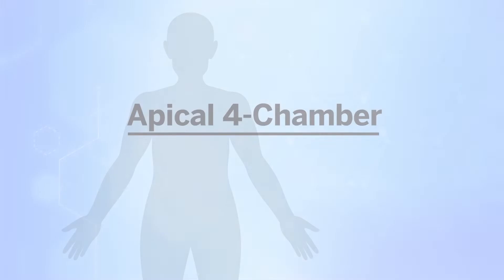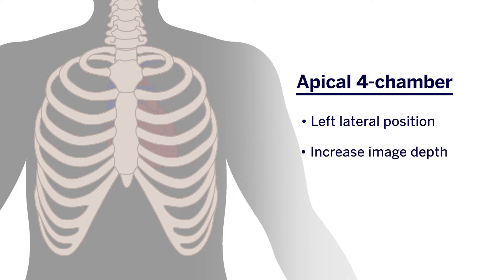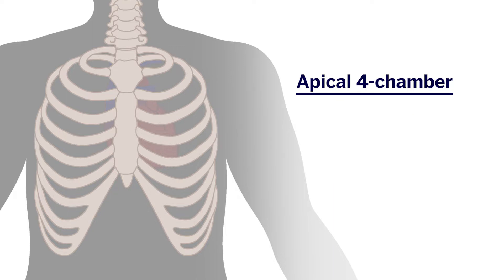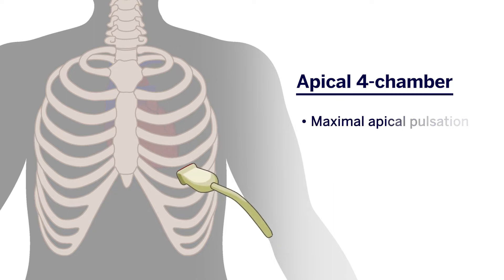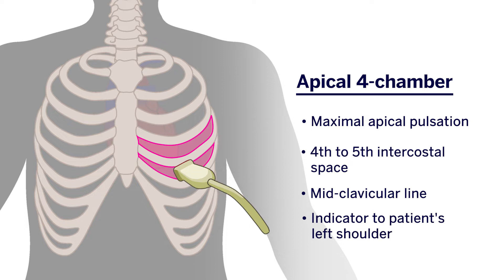Starting off with the apical four-chamber view — this view can be challenging to master, however it is a very important view for chamber and valve function quantification. To improve our imaging windows, it is imperative to optimize patient positioning by placing the patient in the left lateral position if possible. You will also need to increase the depth of the image. The ultrasound probe is placed at the point of maximal apical pulsation, which is generally the fourth or fifth intercostal space in the mid-clavicular line. The probe indicator should be facing towards the patient's left shoulder, as indicated by the blue arrow in this image.